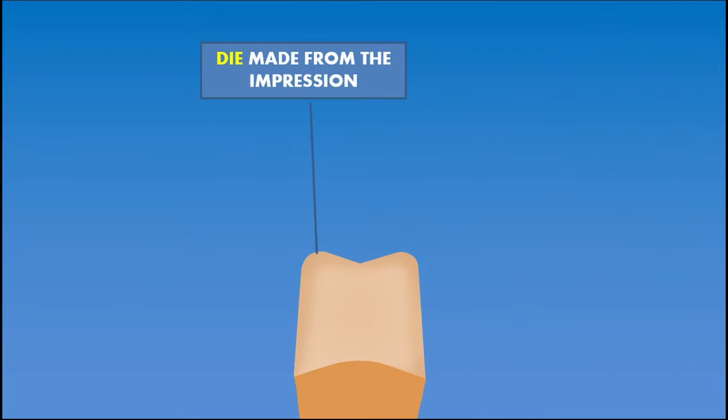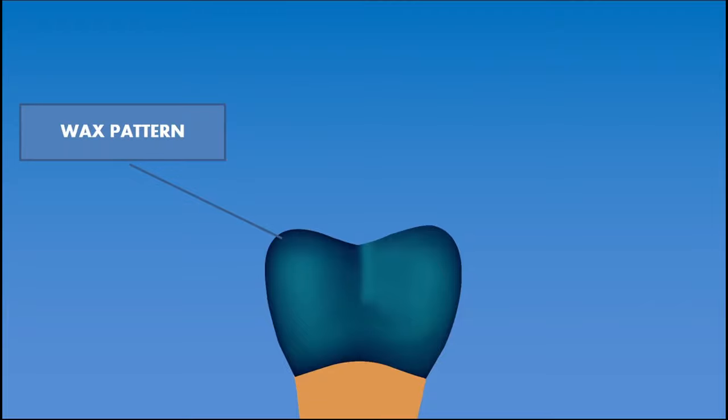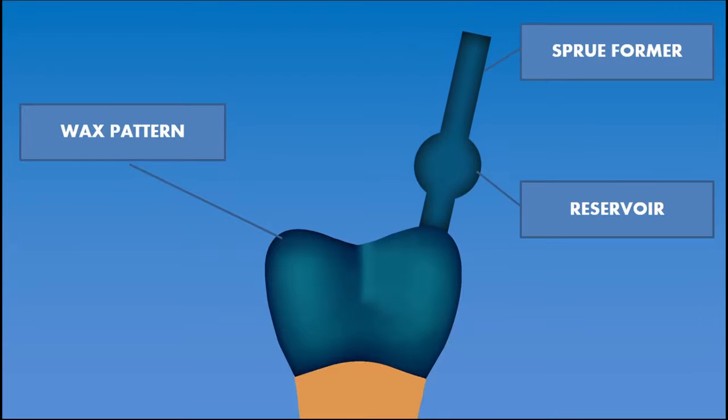Over this die, using inlay wax, the wax pattern is constructed. This wax pattern should have the anatomy, morphology and all resemblances to that of the tooth. A small piece of cylindrical wax called a sprue is attached to the bulkiest portion of the wax pattern which will act as a pathway for the entry of the molten metal in later steps. Around 2-3 mm from the position of the attachment of the sprue to the wax pattern, a reservoir is attached. Now the construction of the wax pattern is complete.